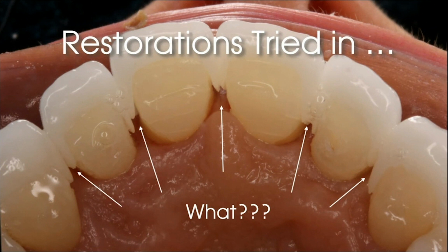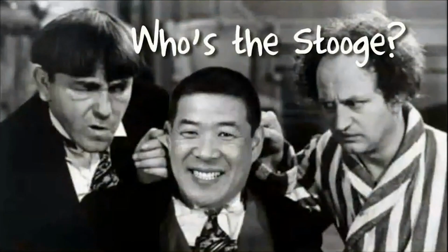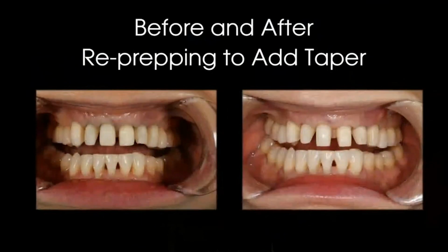I'm left with open margins, or I can try to seal that with composite, which I don't like to do because it's much more difficult to maintain gingival health. So I always like to say, who's the stooge? And it was me. I was just being stubborn and trying to be overly conservative.